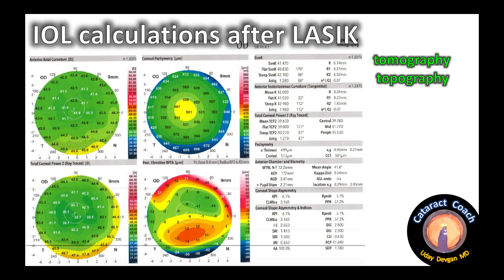The top right picture is the corneal pachymetry — this is important. We can notice that there's been thinning of the central cornea, which means the patient had a myopic LASIK done where the central corneal power was decreased on the anterior surface. The pachymetry is about 500 microns in the center, and as you go out it gets progressively thicker.